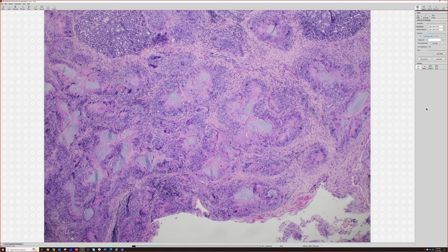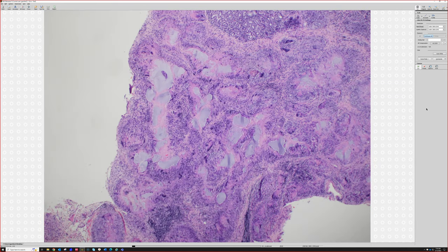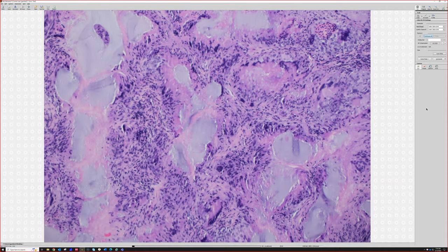I feel like inflammatory more. Inflammatory, good. Yes, it is. It's an inflammatory reactive process, not a neoplasm. But it's so cellular, you could think of a neoplasm. What was the other comment? Oh, yeah, I was just going to say some sort of foreign body granuloma or something. Indeed. These are really robust granulomas.